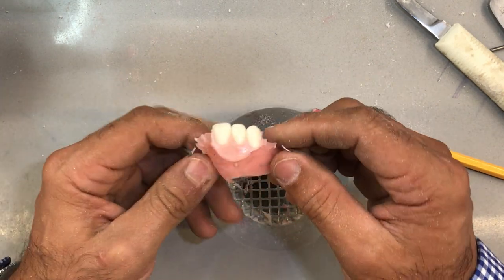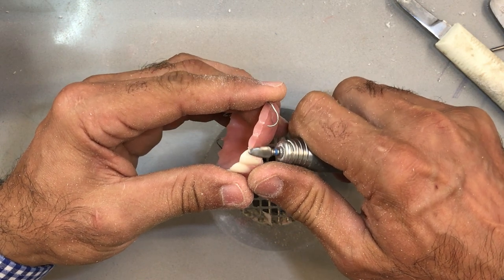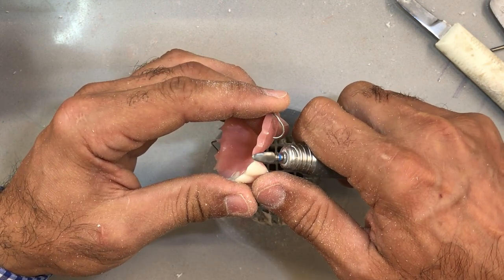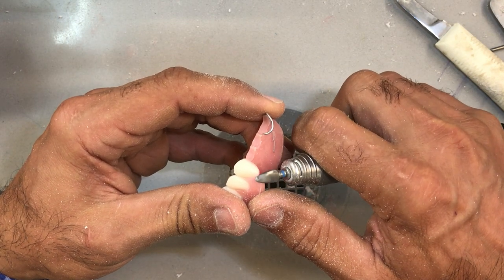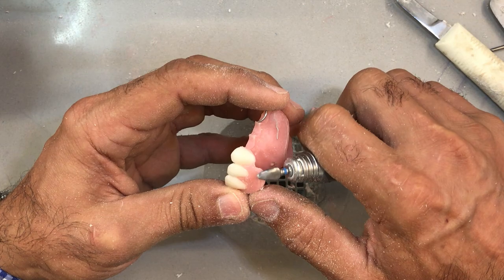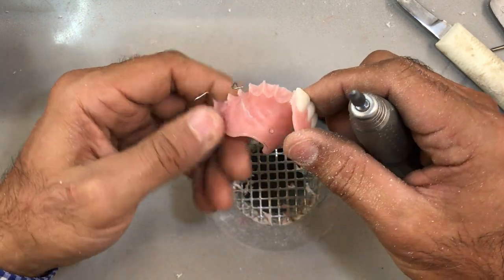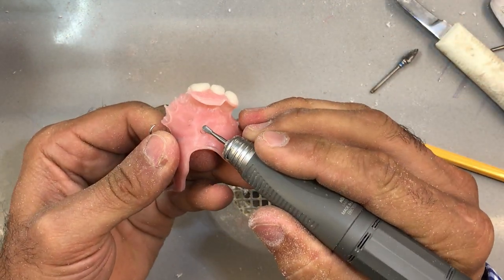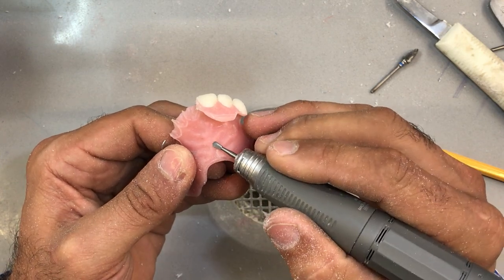This one is going to be an immediate, so it's going to have a ridge lap finish, whereas the lateral and the central are going to have a flange. I've got a smaller burr to get rid of those little projections on the inside of the palate so we don't forget. I'm going to go back to the lathe on this one with a much smaller grinding stone. I like using this on the lathe because it creates a perfect angle for me to see where I'm going to cut this back.